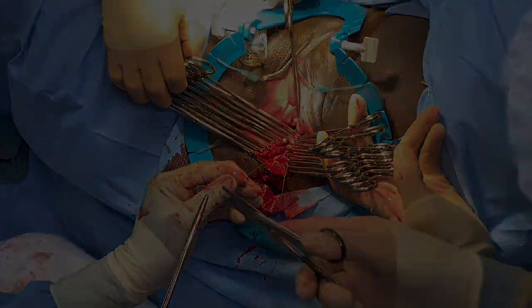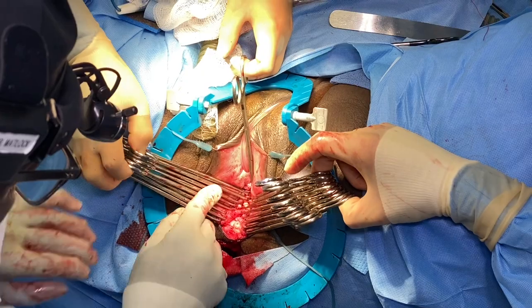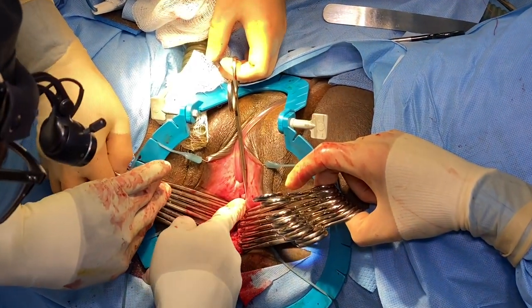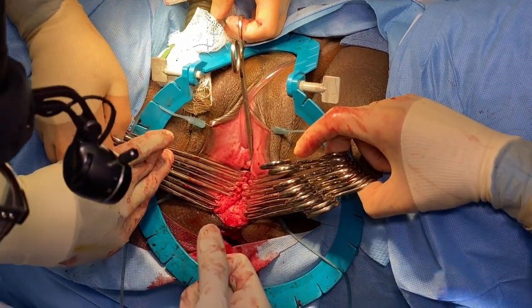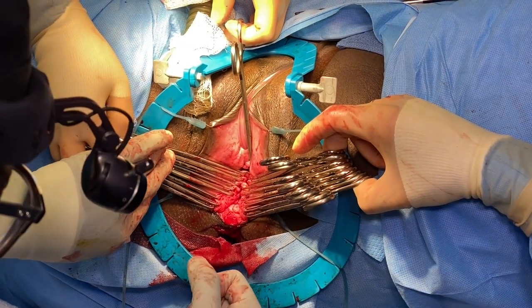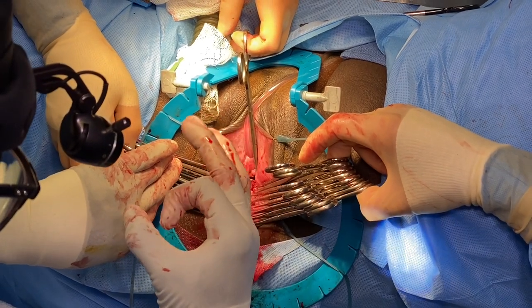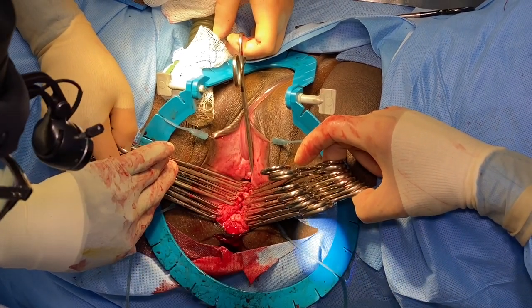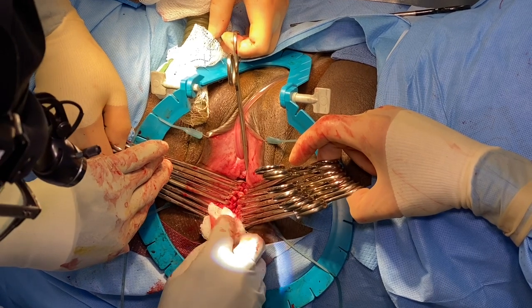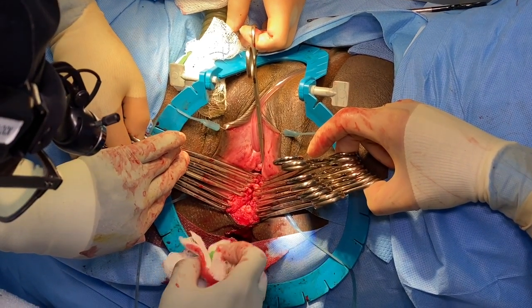We'll bring you back in. Now we can completely reconstruct it, these levator ani muscles all the way in, all the way out. It's going to enhance tone, strength, okay? Contractile force. We'll be decreasing the overall diameter of the vagina as if she never had children. These are the superficial and deep transverse perinei muscles. I'll close those after I close this.